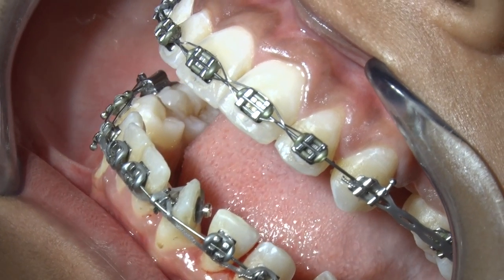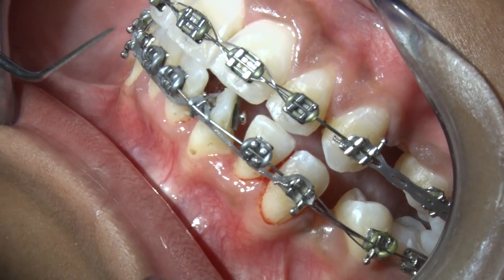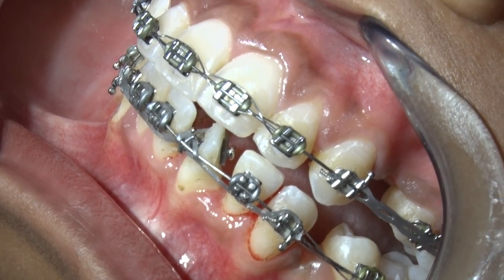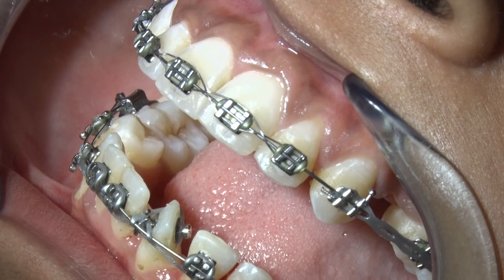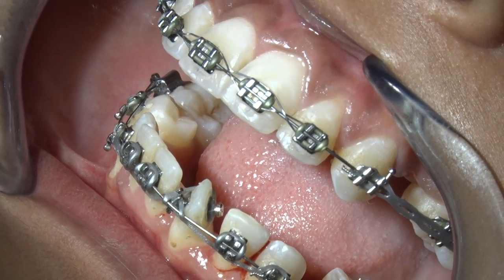If you cannot stick the full bracket, it can be cut. You can actually take one premolar bracket and make four buttons by cutting it.